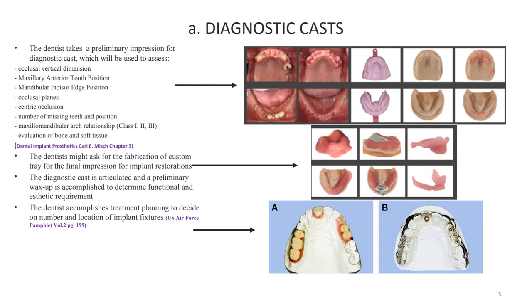In this presentation, we're going to talk about the preliminary work that's done before the surgery. And we're going to talk about diagnostic wax, diagnostic cast, surgical stents, and radiographic stents.